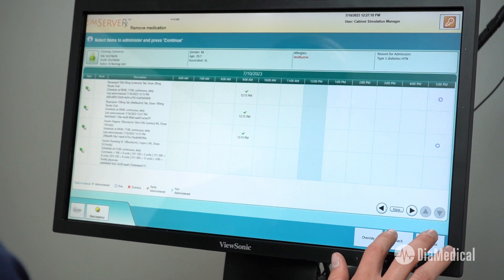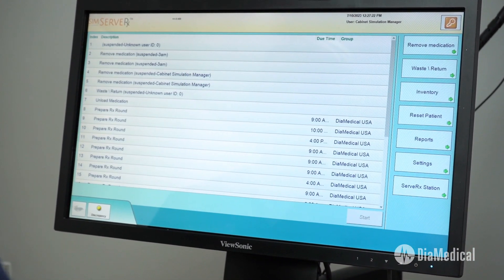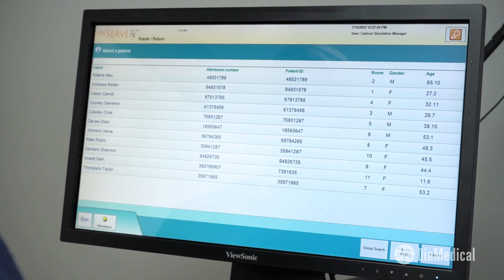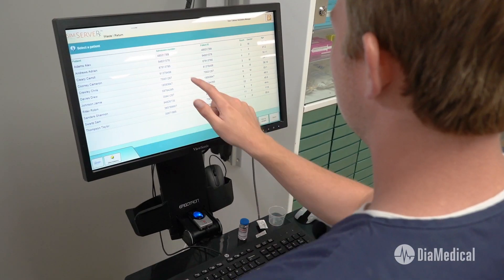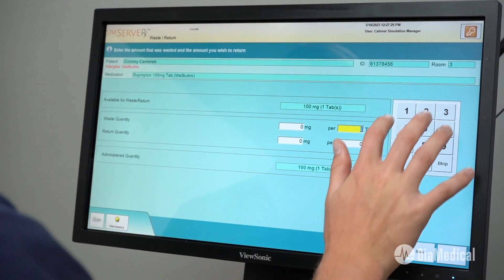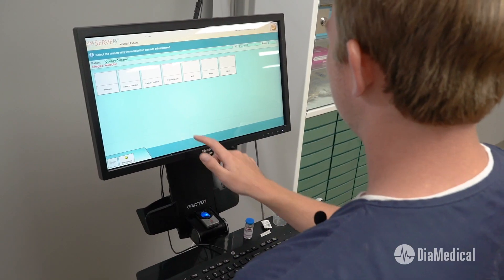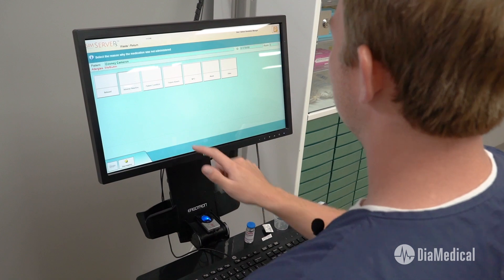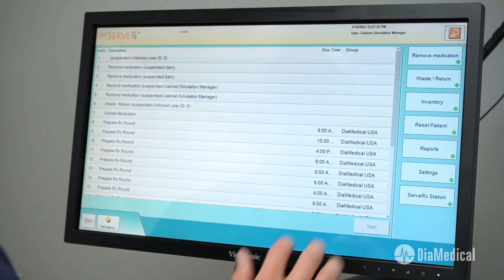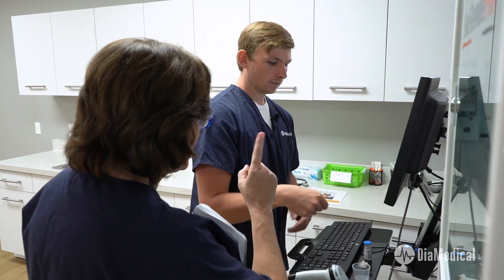Okay, go ahead and hit back. Hit done. Waste and return. Cameron Cooney. Select bupropion. One. Continue. Adverse reaction. Okay, that can go right in the return bin. And let's go drop his insulin. Sounds good.